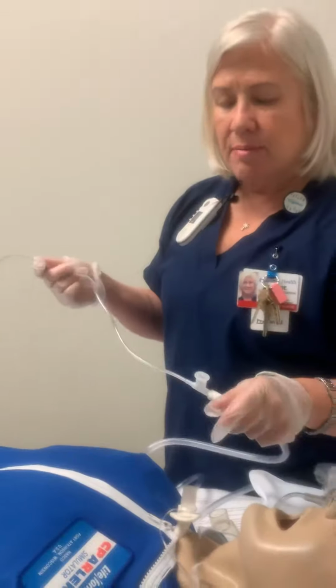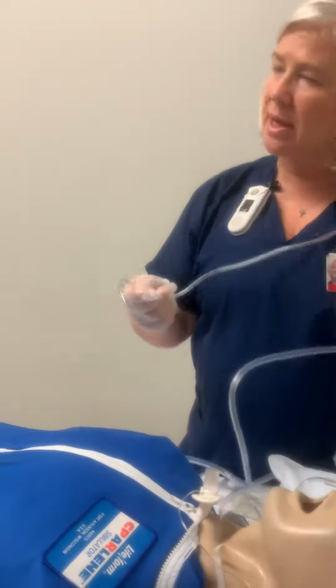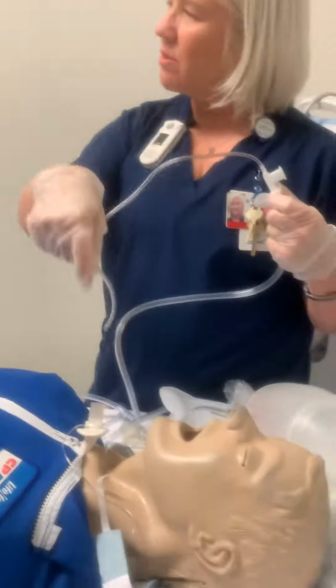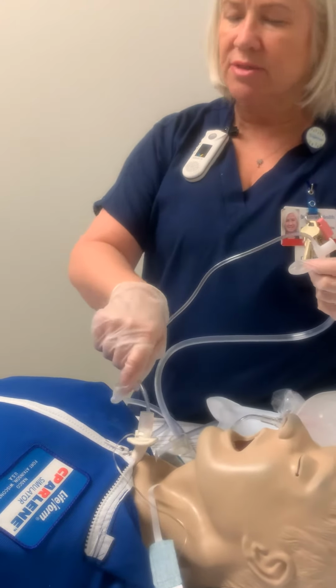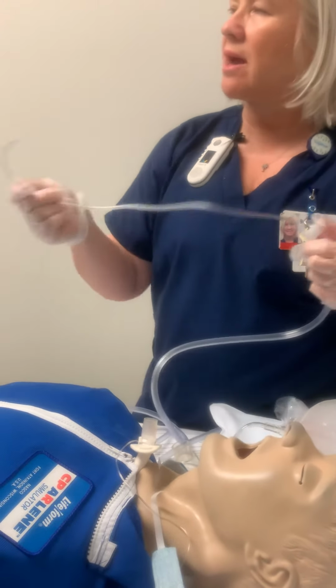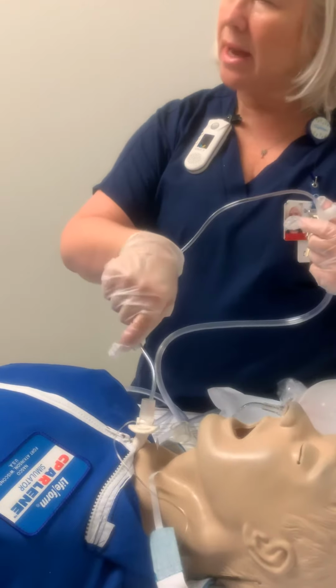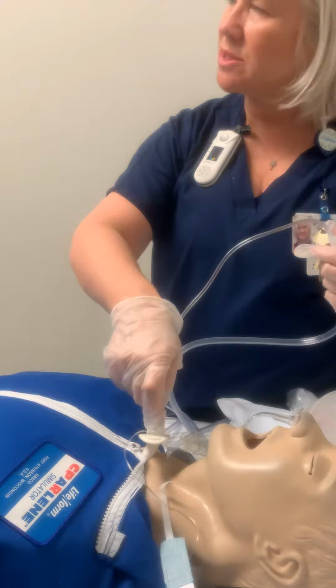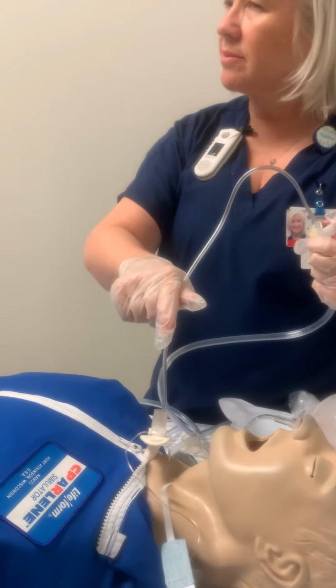But let's say, for instance, I'm getting ready to suction this patient, but there's a bunch of stuff right up here in the very front. Do I still want to continue going down? No. Usually you want to go in just enough to get all that, bring it out. Let them get their wind back, and then you want to go back in. Maybe do a little bit deeper suctioning on the patient. Okay? Questions?